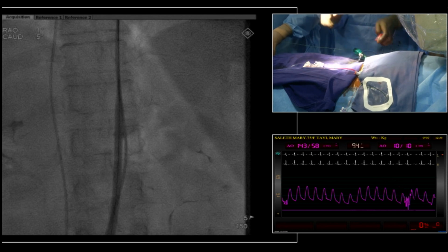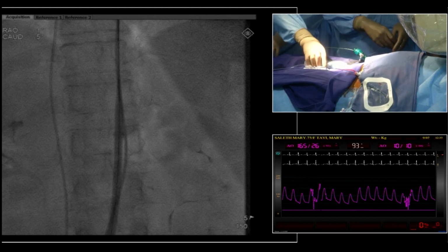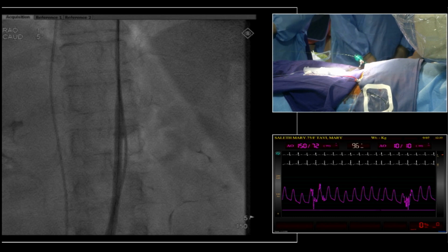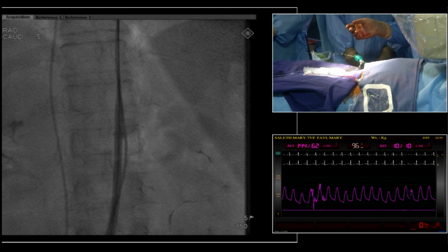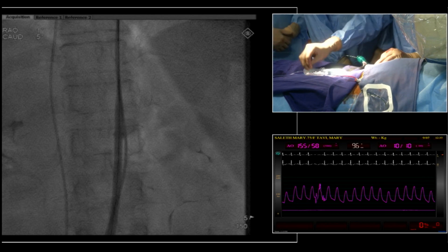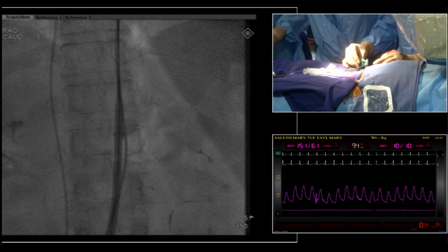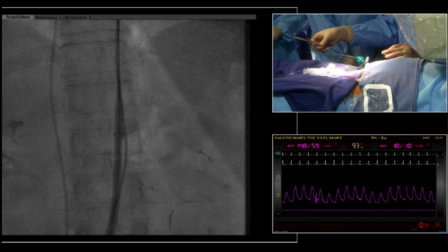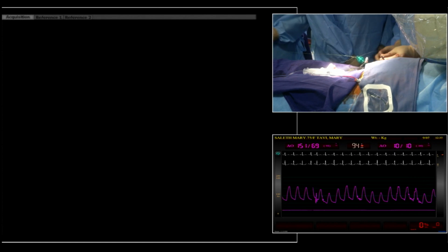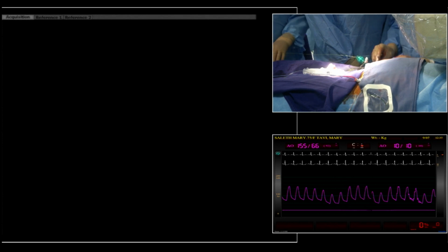In fact, that is a very important point, that at any point in this whole trajectory, if the vessel size is less than 6, because although it is a 16 French sheath, it will expand inside once we put the valve inside. So it has to have the vessel size to accommodate the valve, because it goes up to 24 once it splits inside. And skin preparation is also very important. Have a suture, please.